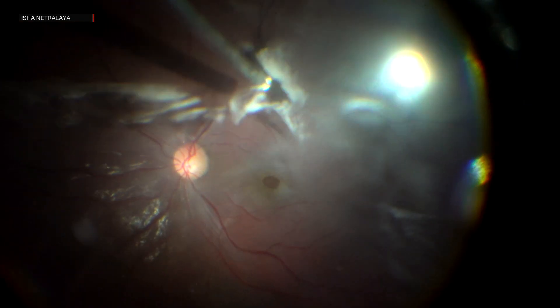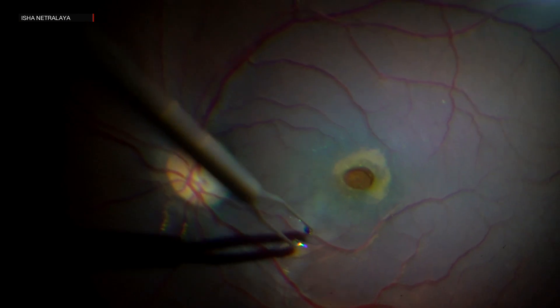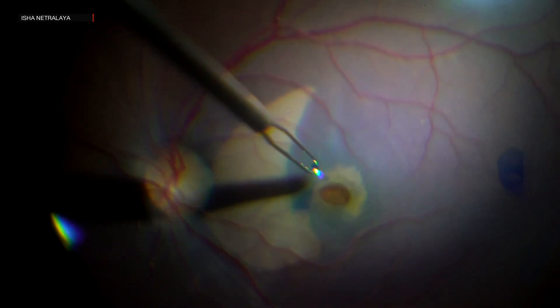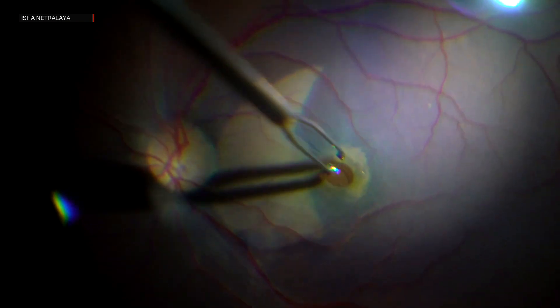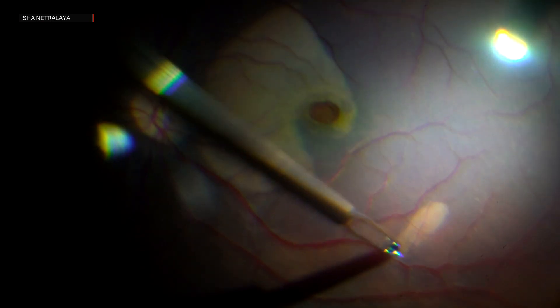After that, the vitrectomy was completed. The ILM was then stained with brilliant blue. The nasal ILM was then peeled using centripetal force. A temporal flap was made and it was carefully inverted over the macular hole.